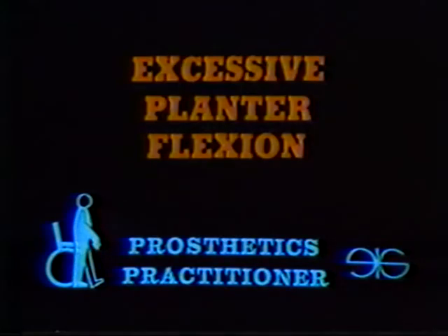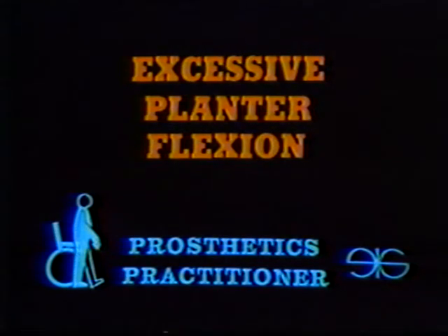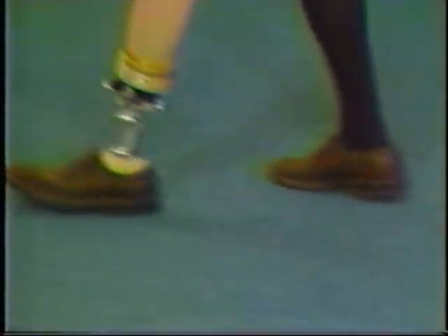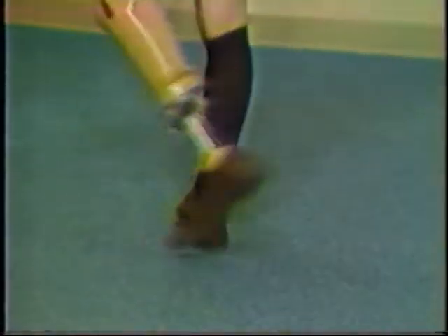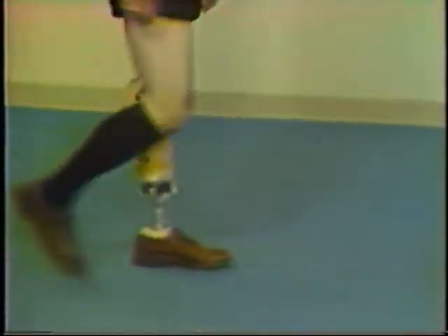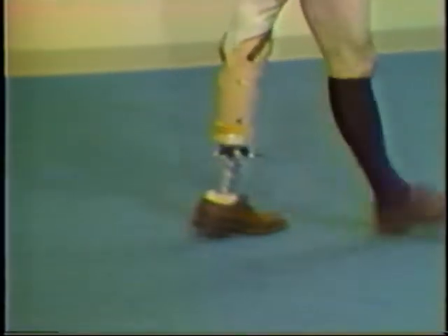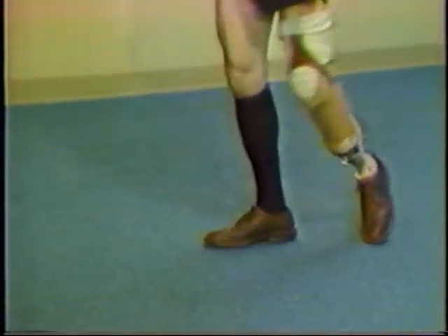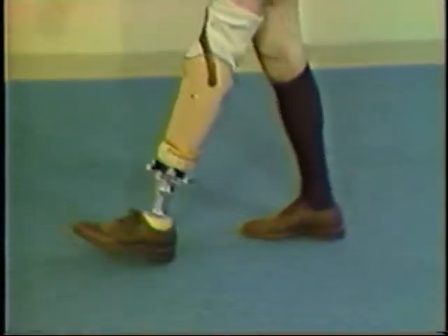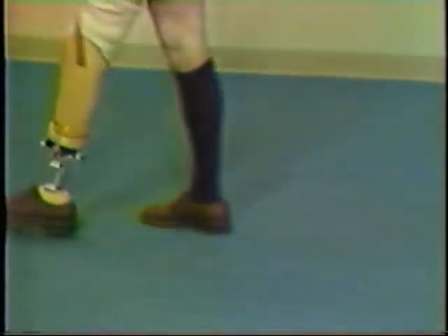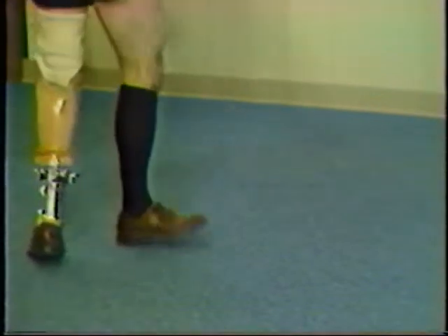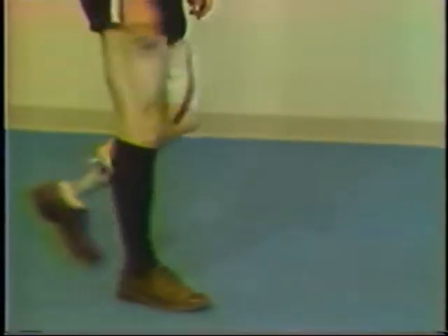The final deviation we will observe here is excessive plantar flexion. The amputee may complain that it feels like walking uphill. Notice how the heel comes off the floor too soon and the knee is hard to flex. This deviation can be caused by a foot which is too far anterior, too much plantar flexion in the foot, or too soft a heel wedge.